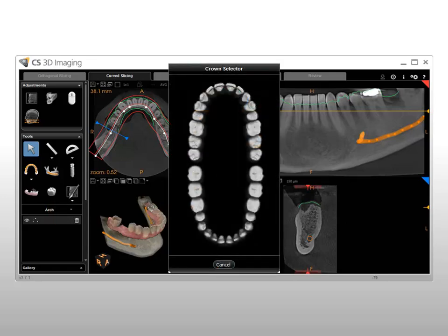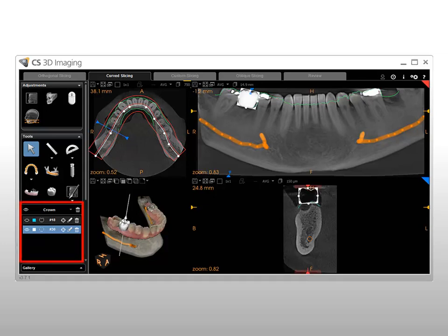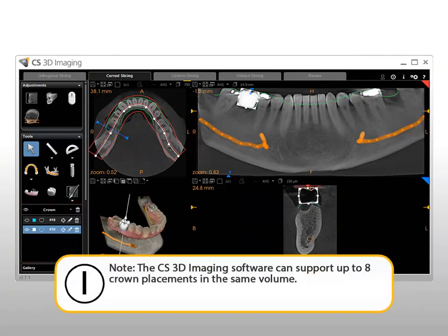The Crown Selector window is displayed. Select the appropriate crown number by clicking on the corresponding tooth image. The crown is placed in the position defined on the patient volume and is displayed in the crown list of the Object Management panel. Note: the CS3D imaging software can support up to 8 crown placements in the same volume.